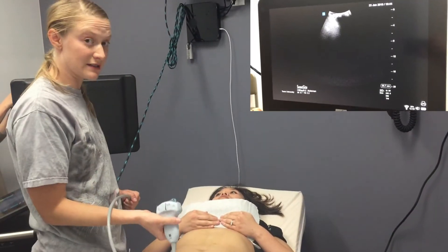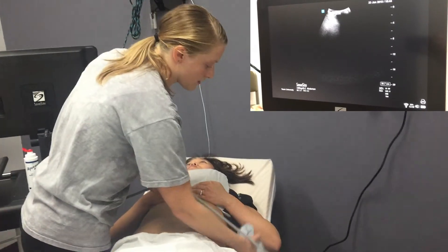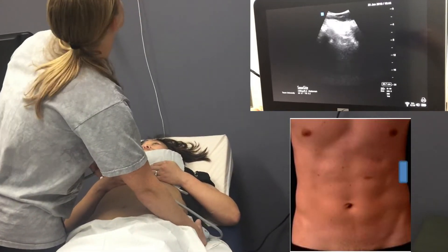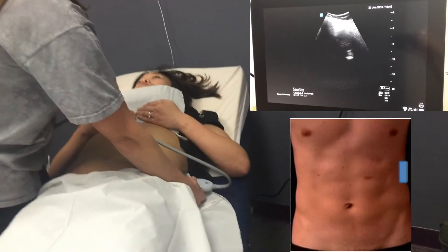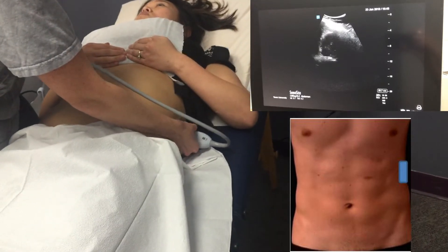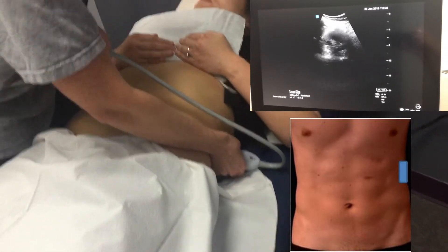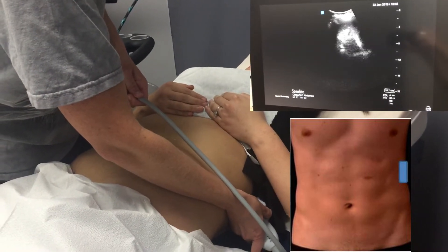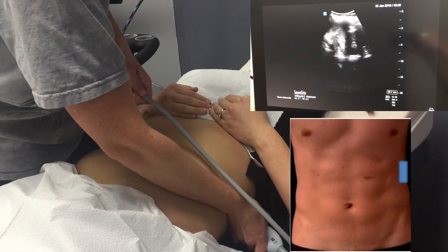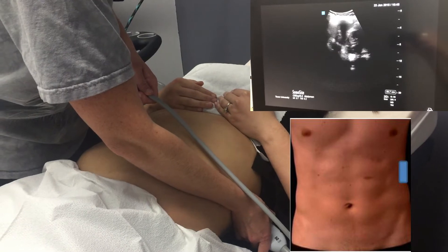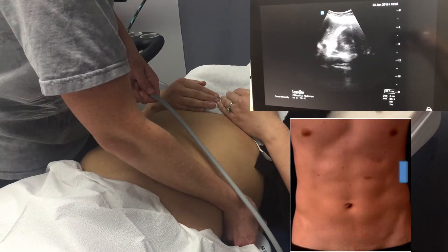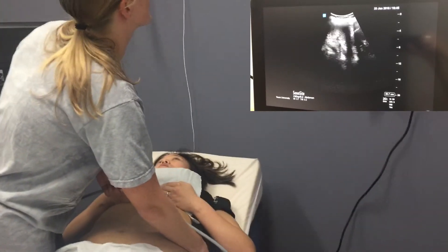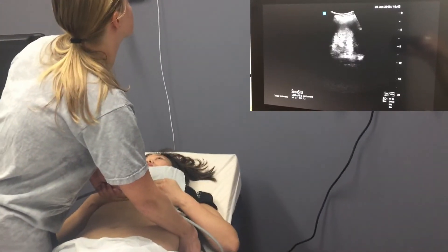We'll move on to the left upper quadrant. For this, your knuckles go to the table, reaching over the patient, because the spleen is going to be more posterior. Here we can see the kidney and spleen, and we also want to make sure we can see the diaphragm. The most dependent area in this region is between the spleen and the diaphragm.